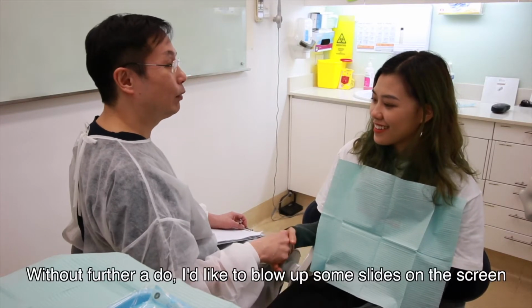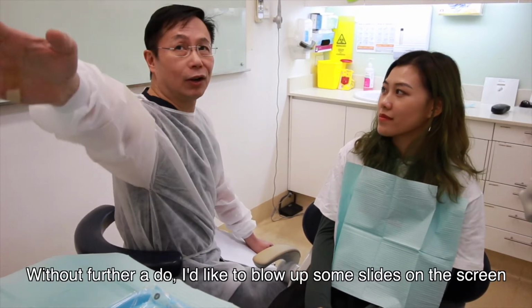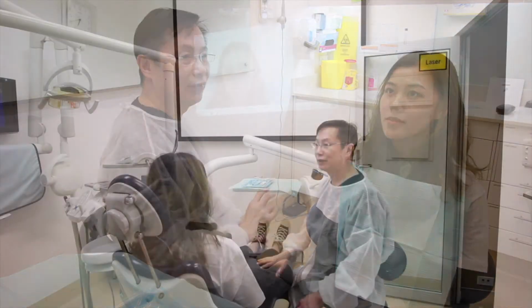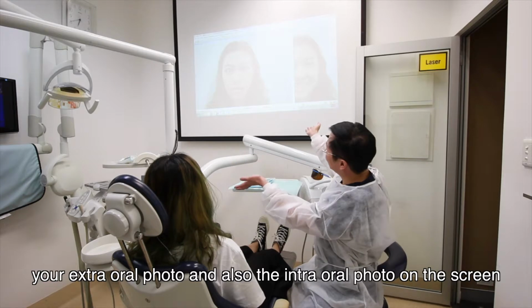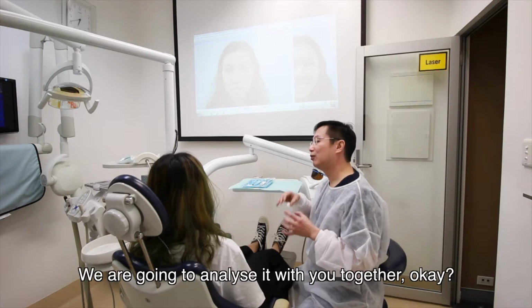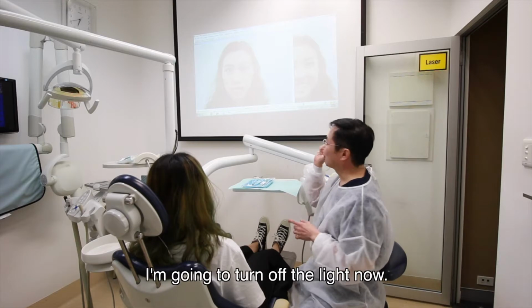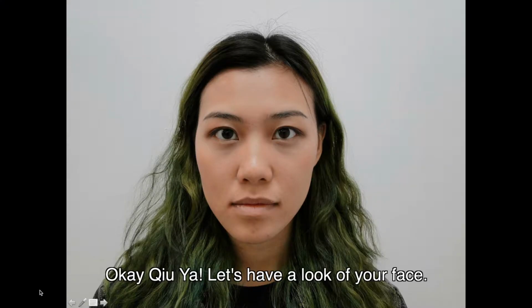Okay, thank you. Without further ado, I'd like to blow up some slides on the screen so we can analyze it together. Okay. So now we have your photo on the screen, your extraoral photo, and also the intraoral photo, and also all your x-rays, and we're gonna analyze it with you together. Is that okay? So I'm gonna turn off the light right now. Okay, yeah, let's have a look at your face.